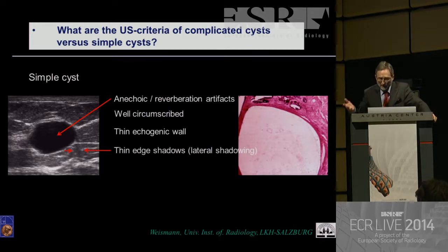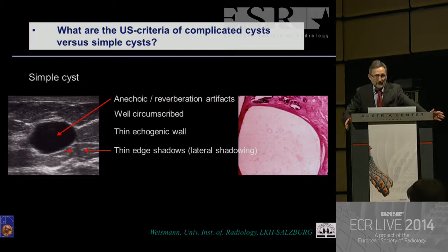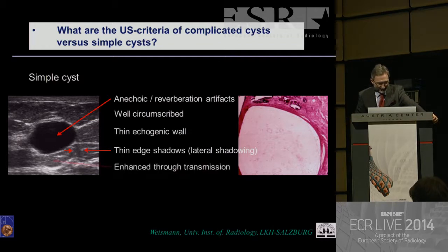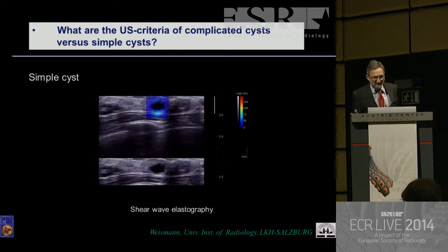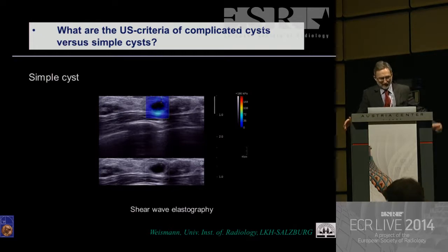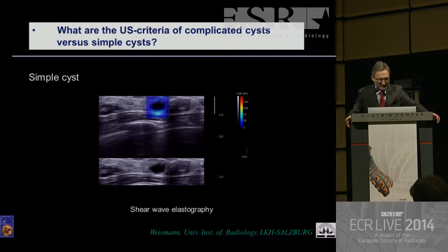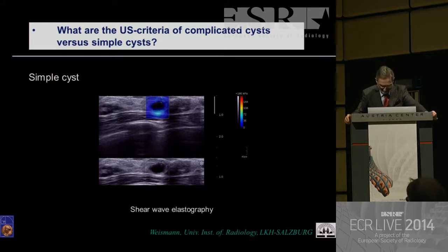If you're working with compound imaging, you can reduce this type of shadowing. If you're not working with this artifact reduction, you will see it more pronounced, and enhanced through transmission. A simple cyst, if you're working with shear wave elastography, you don't see shear wave propagation in the fluid, so it is more or less a black hole in this lesion.